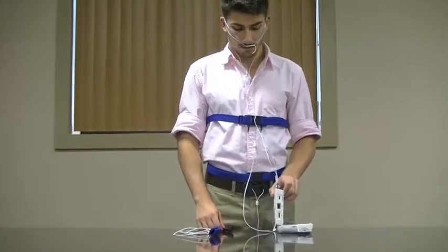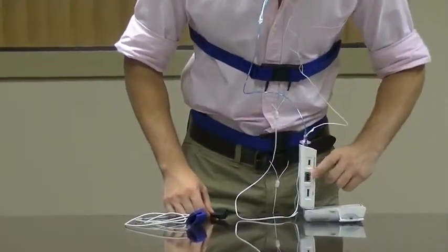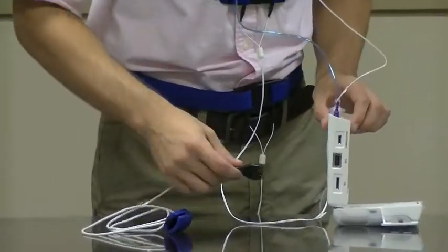Next, you will want to attach the oximeter. First, you will plug it in onto the side of the device and then attach it to your index finger.